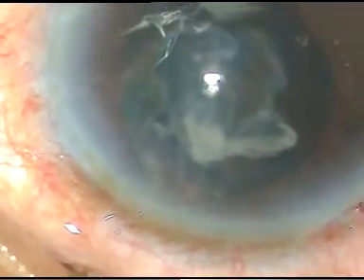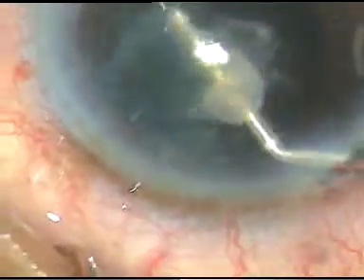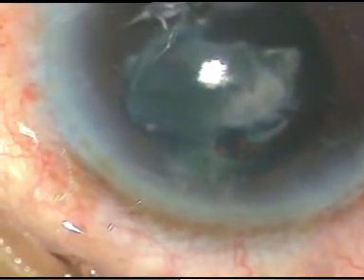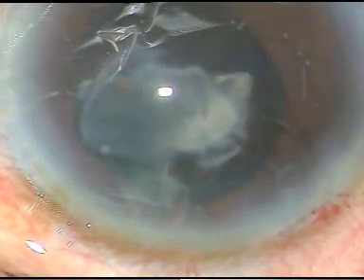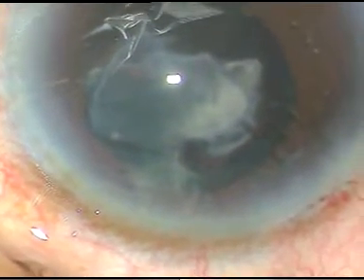And now my plan of management is I'm going to implant an intraocular lens which will act as scaffold, and I will then use the cutter to remove this epinucleus.